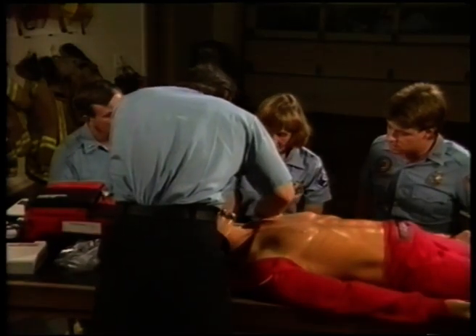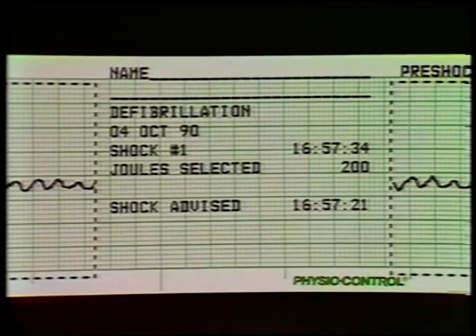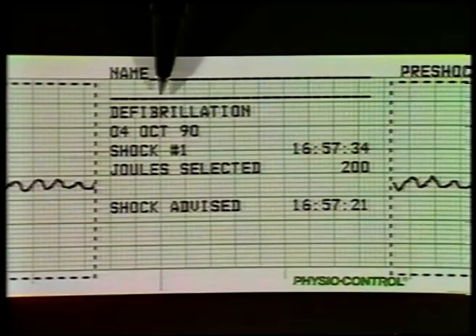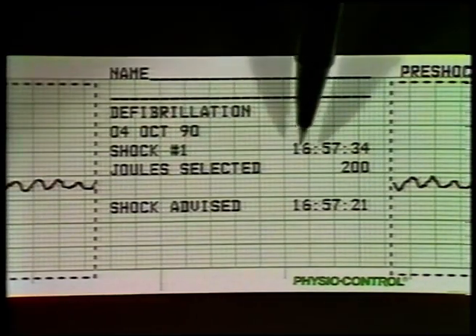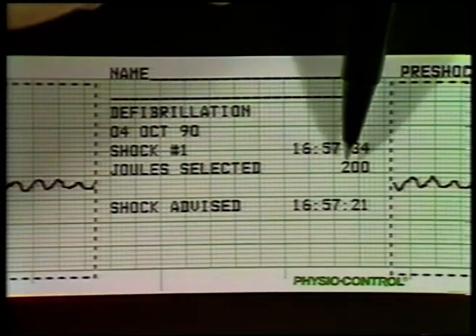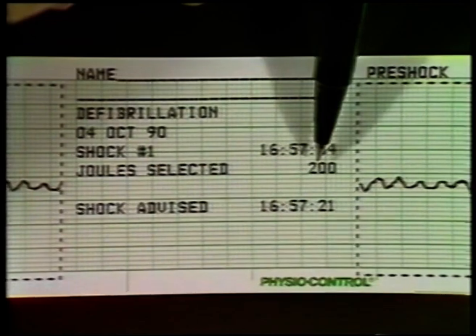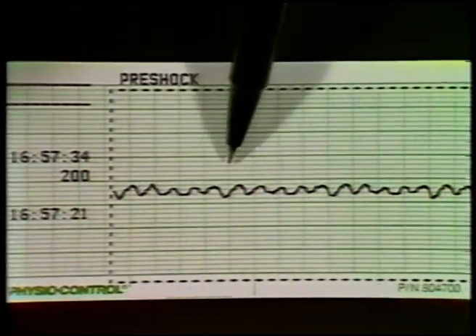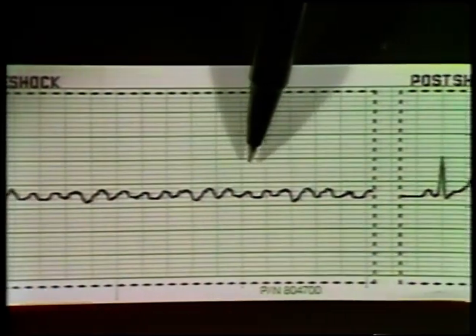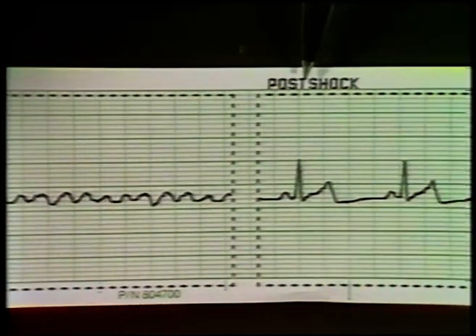Now the defibrillation format. Again, you have a space for the patient's name and whether the shock was delivered manually or, in this case, the advisory mode. There's the date, the sequential number of the shock, time of energy delivery, and the number of joules delivered. Then you get 3 seconds of pre-shock ECG and 6 seconds of post-shock ECG. This information is printed for each shock.